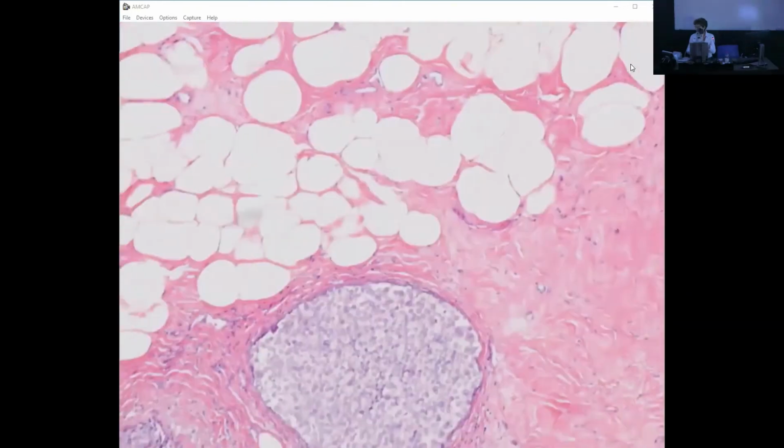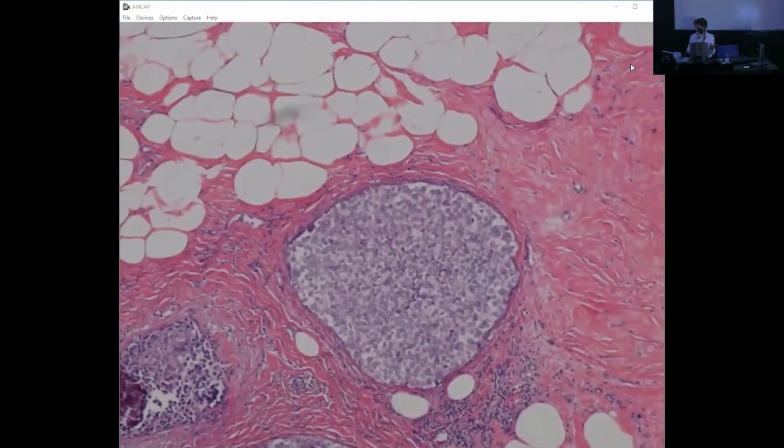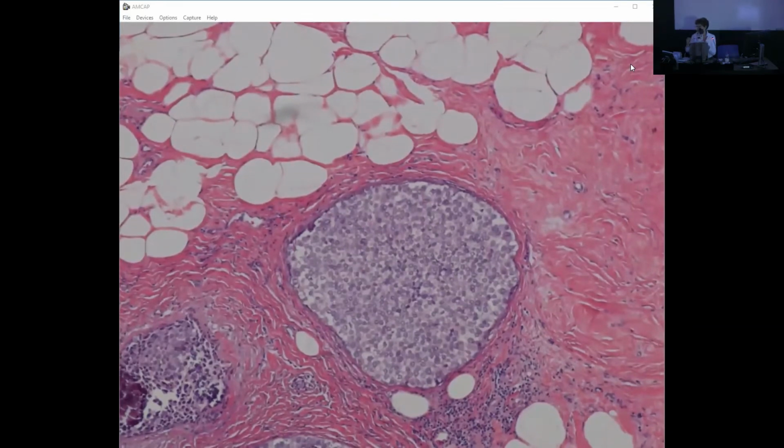And you always have to consider the possibility of florid LCIS or pleomorphic LCIS when the proliferation is entirely solid. There are no glands anywhere, because these cases can be very easily diagnosed here, but they are not uncommonly mistaken as DCIS once again.